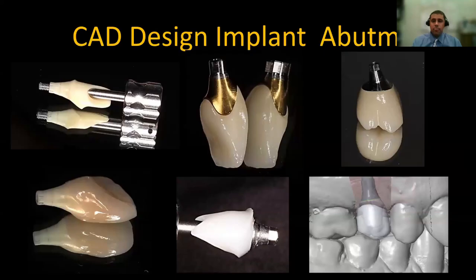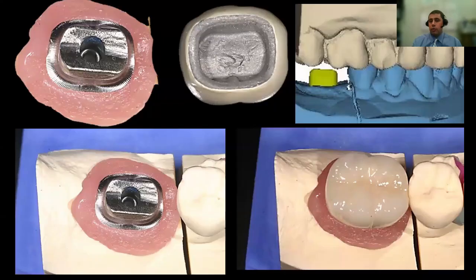Again, they come in different materials. They could be zirconia, titanium, hybrid, but it's fully customized, and they are purely patient specific. If I look, for example, at the intaglio surface of this crown, I would have thought that this was done for a crown preparation, a very good crown preparation with even a seating groove. And what you see here is actually the intaglio surface of an implant restoration fitting on a fully anatomic titanium CAD/CAM abutment.